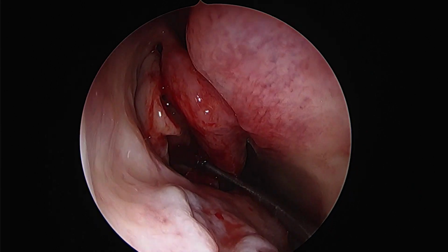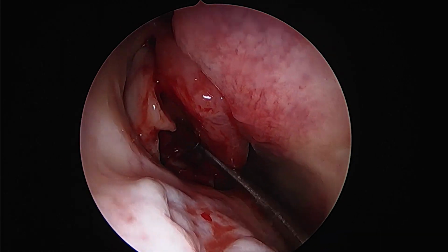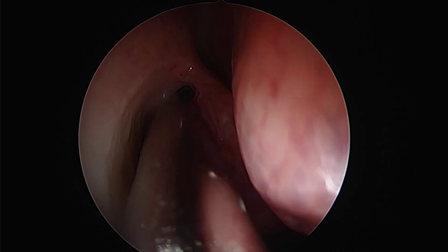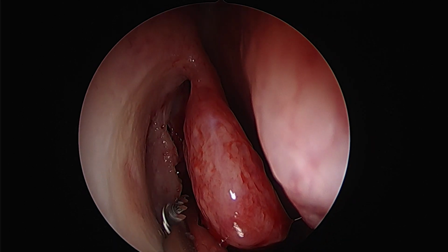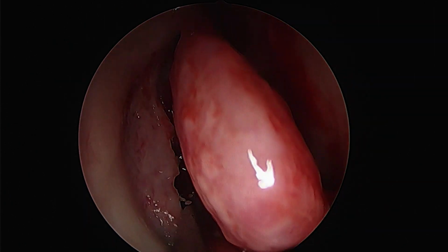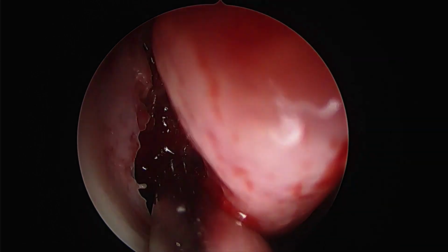We can see here that a high deviated nasal septum is present. Sometimes that can also necessitate surgical correction. In this patient, we chose to avoid it because, eventually, with the defect being in the cribriform plate, we will be required to excise the middle turbinate as well, which should give us a reasonable amount of space required for the access.